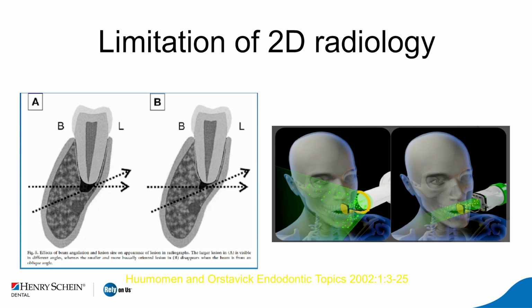So sometimes I have doctors who tell me, I'm afraid to take a 3D because what if I don't see a lesion? Well, the lesions are there on 2D. It's just that they are more difficult to assess, but you still need to look at the whole radiograph. So sometimes it's a very good help.